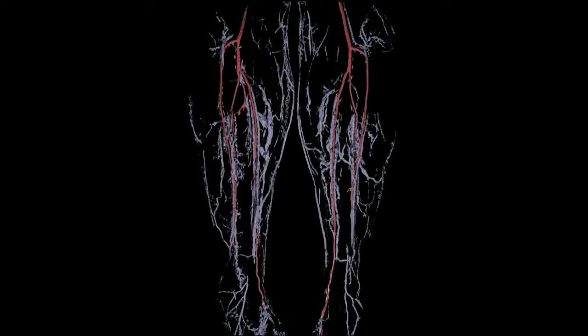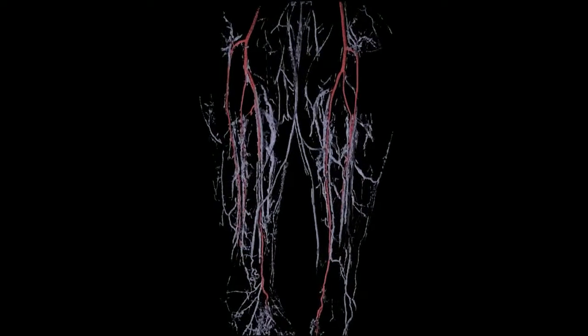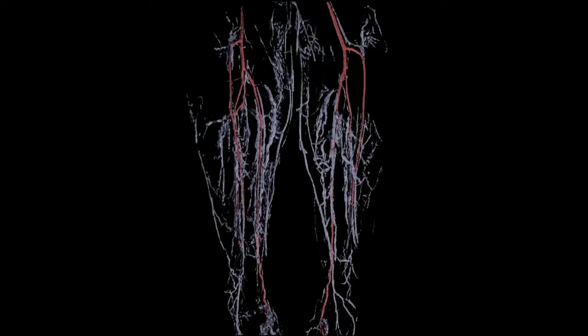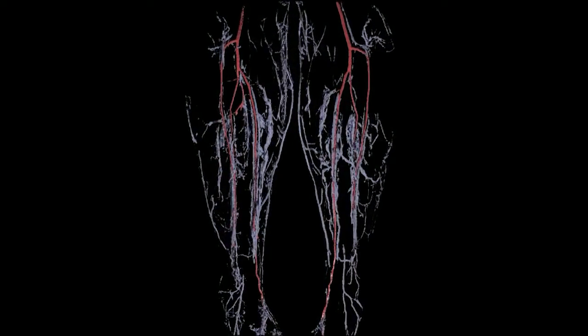So this is a segmentation that was performed with standard vessel segmentation methods, vessel tracking. It performs not too badly in the arteries, although you can see more distally once you run into any disease or stenosis, it doesn't work particularly well, and the veins are incredibly variable. Any bit of deformed vein can happen because since there's such low pressure structures, any bit of deformity means that the tracking just doesn't work and segmentation is extremely poor.